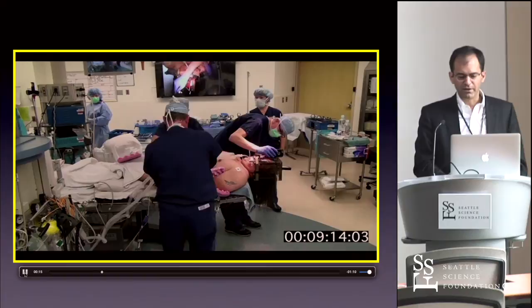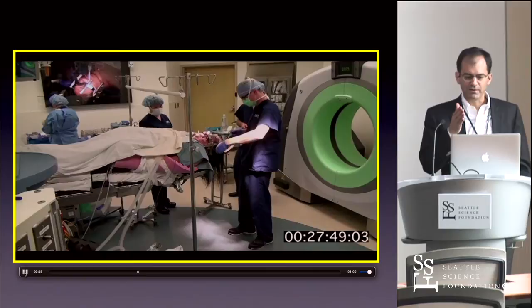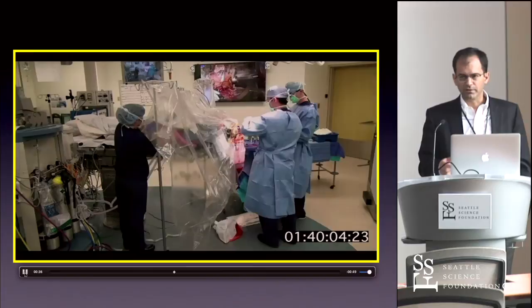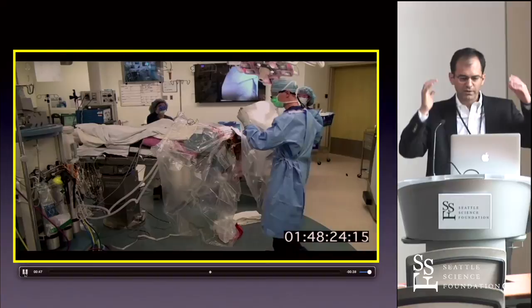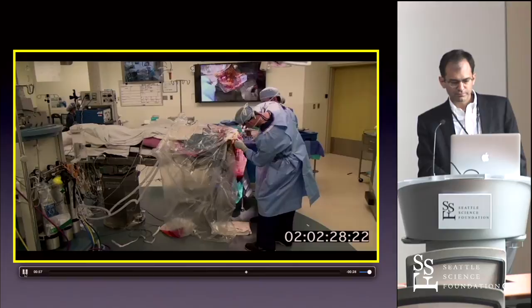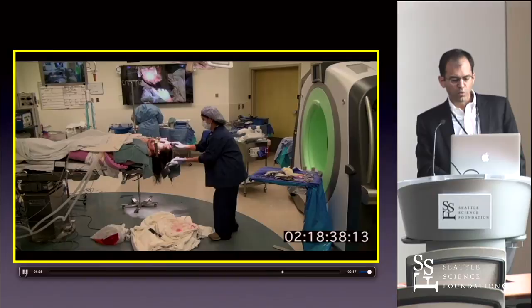We level out the frame using an iPhone, making sure it's the right height. The O-Arm — actually the Body O-Arm — is a portable CT scanner we use to get the stereotactic images, and we clip the hair based on the ring and arc of the Leksell frame. All we're doing is making the burr holes and putting the leads in. Once the leads are in place, we get a scan while things are still open. We have the stereotactic frame arc in place, so if we need to reposition, the threshold is very low.